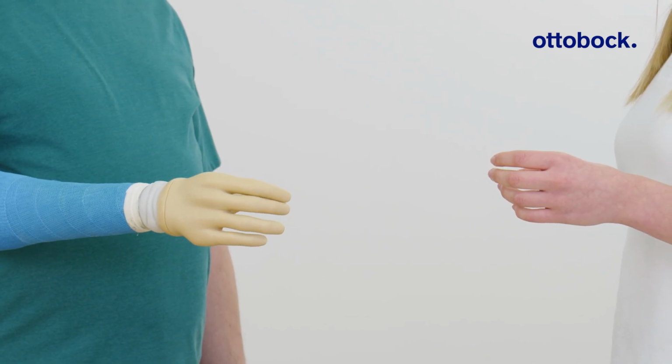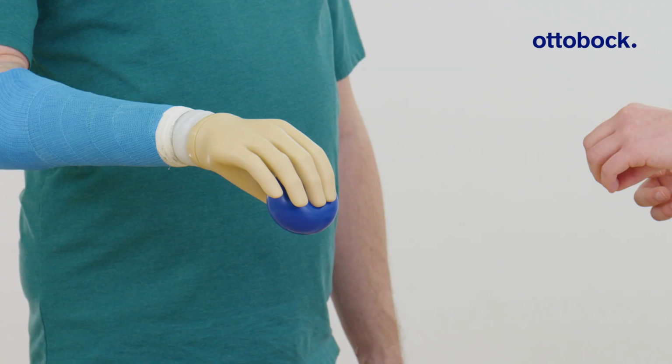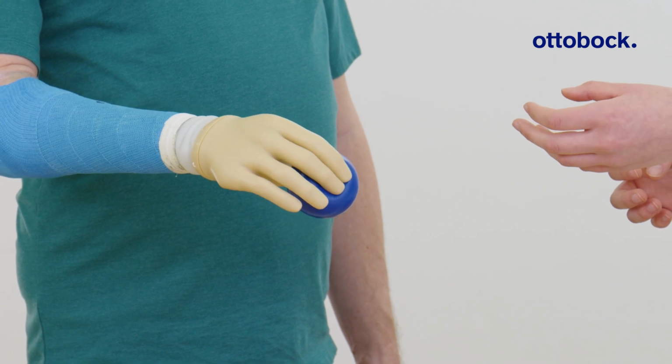Once you've mastered controls training and are ready for the next challenge, you can move on to repetitive drills involving objects.